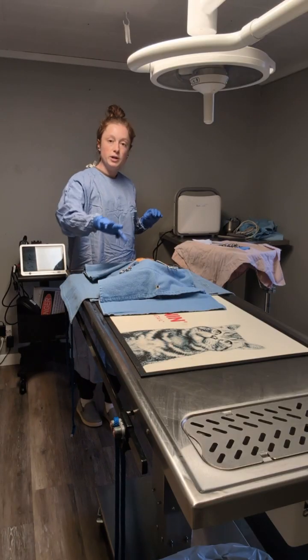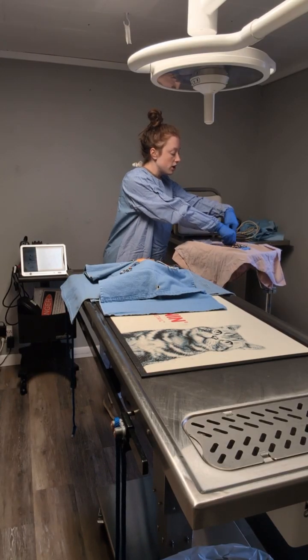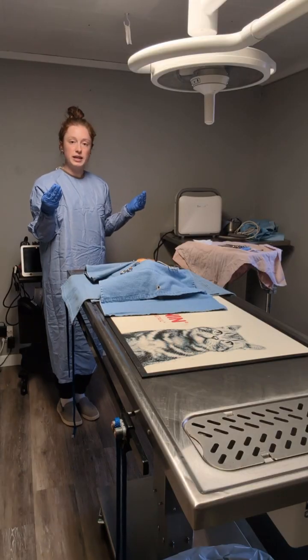This will leave an open square for the operating site. I'm just going to spread out the instruments just a little bit more to make sure that they're easily accessible by the doctor. And then I will stand by to see how else I can assist.